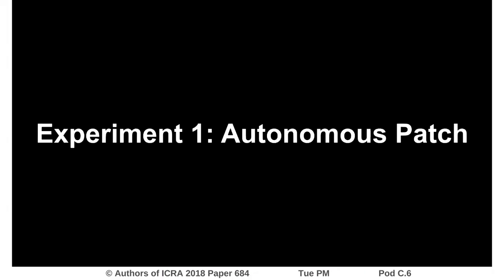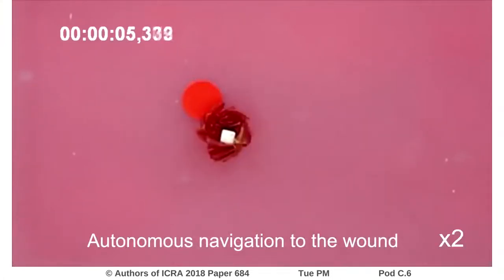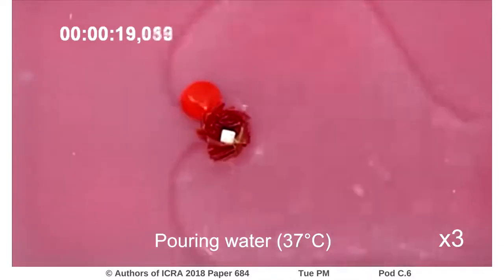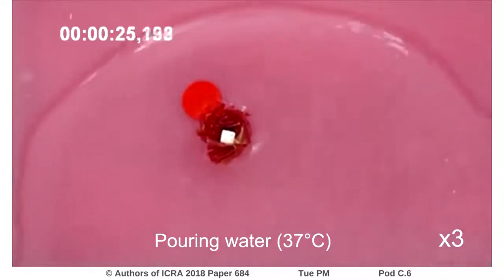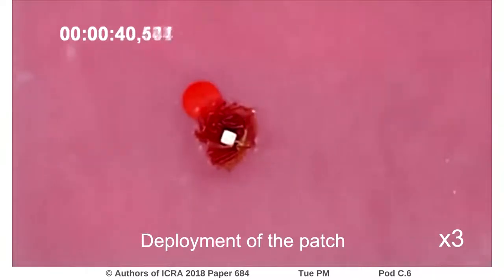Our first experiment shows the origami structure in its folded state, autonomously navigating to a red circle representing a wound to be patched. Once the robot arrives at the target, a strong magnetic field is applied to hold it in place. Warm water is then applied, causing the agarose patch to unfold into its deployed state, which covers the wound.